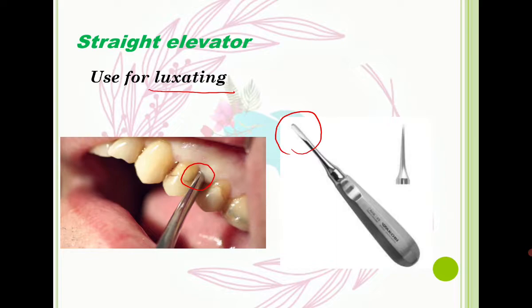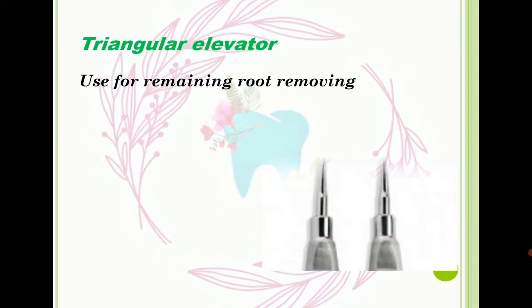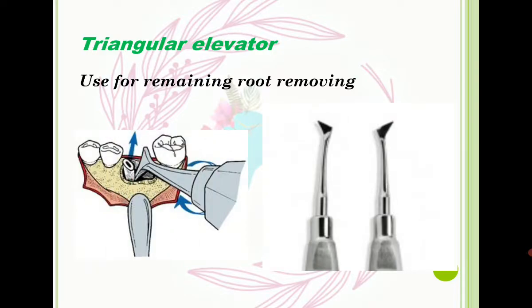The second type of elevator is called a triangular elevator. Pay attention to the blade — it looks like a triangle, that's why it's called a triangular elevator. This is used for removing remaining roots after extraction. If a root fracture happens during extraction, we can use this elevator to reach and remove the remaining root inside the socket.